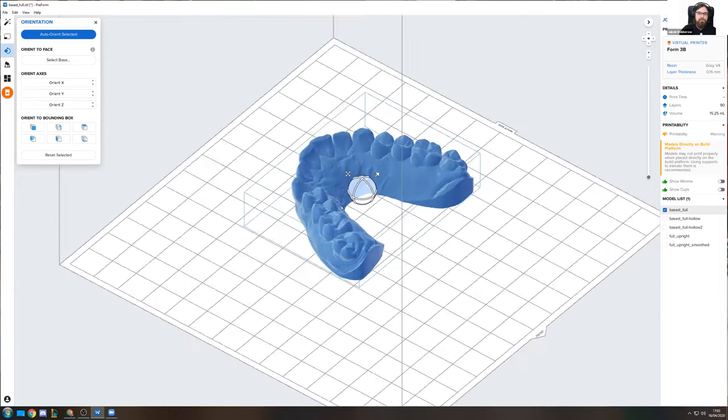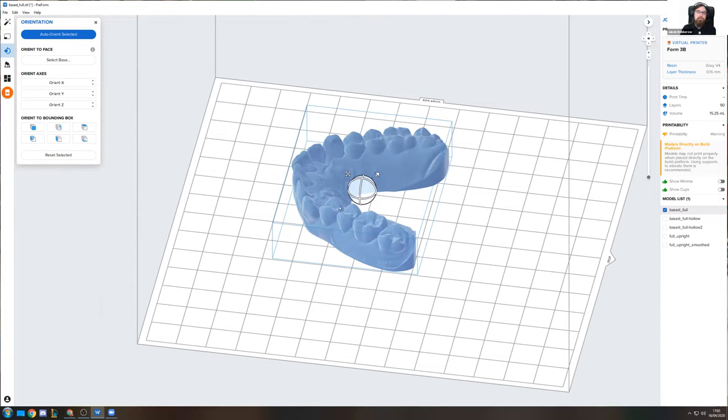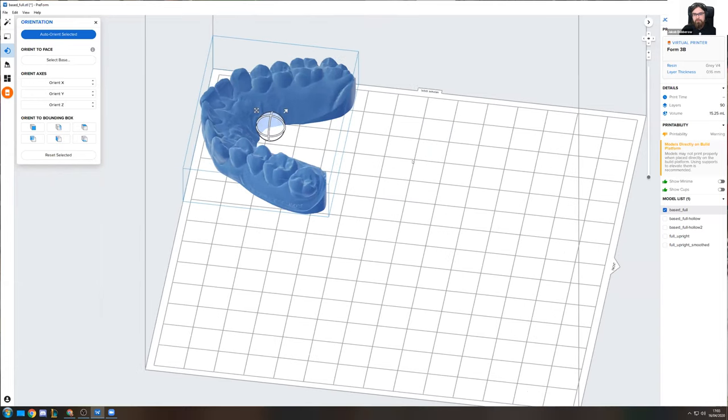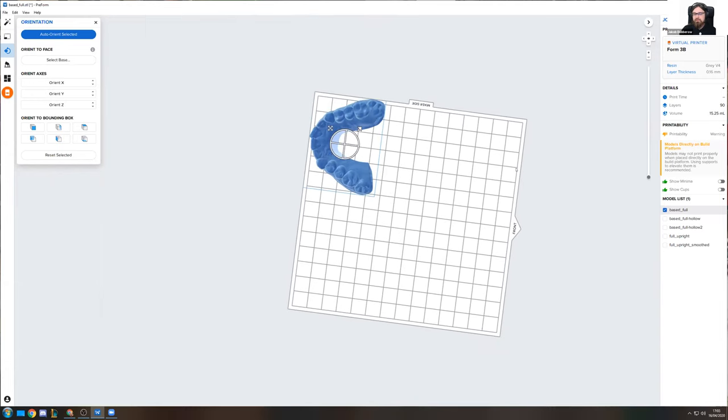Typically speaking, there are two big orientations that you want to strive for. You either want to go for something like this, where you have your models just straight up on the build platform itself. This is something that a lot of people will do. But as you can imagine, if you have your whole arch in the model, the build volume right here like this, you can fit 6, maybe 7 models at the same time. But the advantage of doing it like this is that you don't have a lot of printing height to it. And that is one of the factors that basically affects your printing time by quite a bit. This will typically take around 3 to 5, maximum 6 hours-ish to print these 6 or 7 models right there.